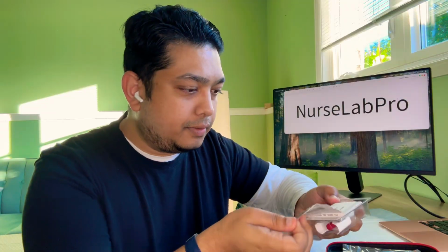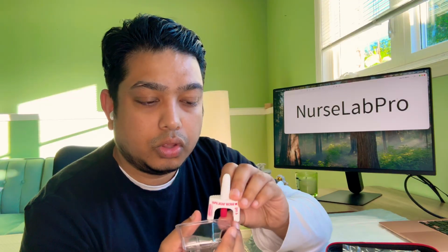Once you open it, it comes with instructions if you do not know how to use it. The first instruction is to try to rouse the patient. You can rub their chest as a nurse and try to wake them up. If they are not waking up, they are semi-conscious or maybe unconscious, and their breathing is less than 10, please do not forget, then we go for a dose of naloxone. So we put them in a position, or you can put them in supine position if they're on the floor, which most probably they would be.